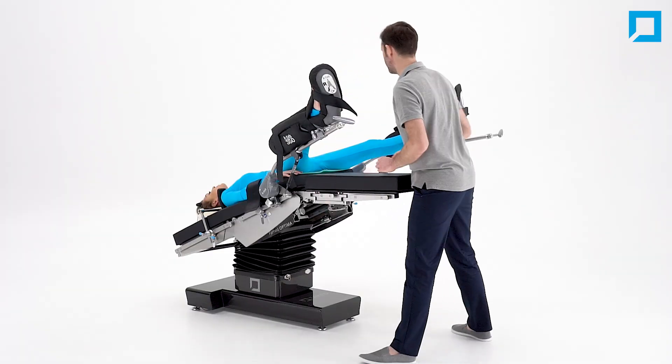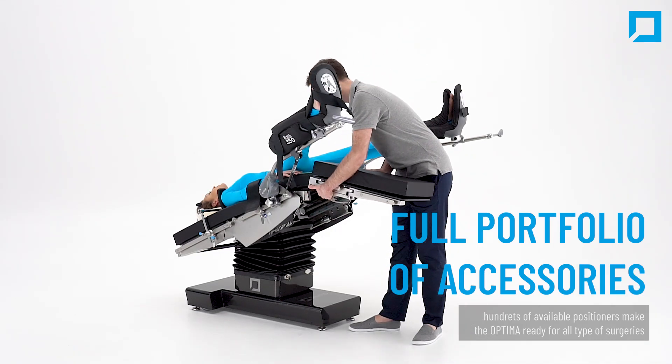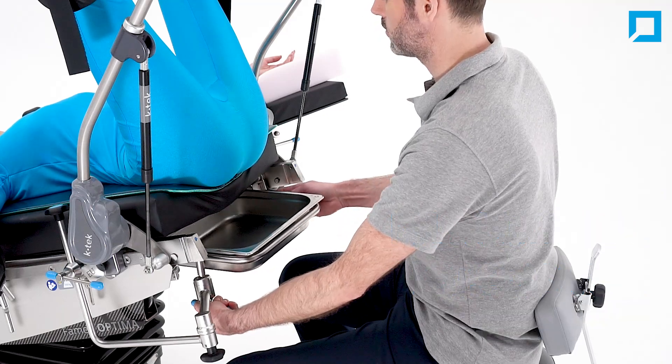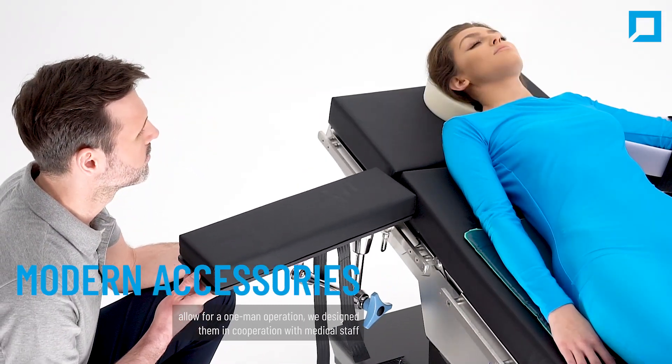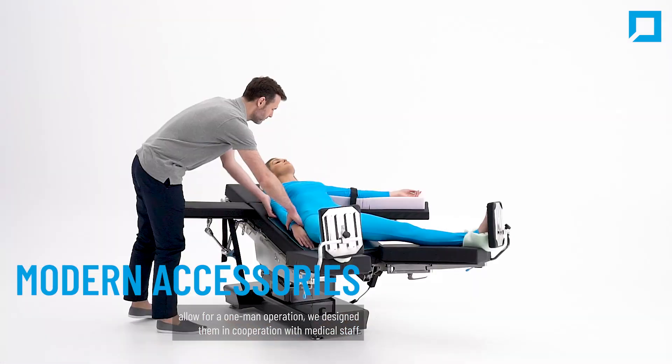Famed produces a complete portfolio of accessories. Hundreds of available positioners make the Optima ready for all types of surgeries. You can use modern accessories to speed up pre-op procedures, allowing for a one-man operation.